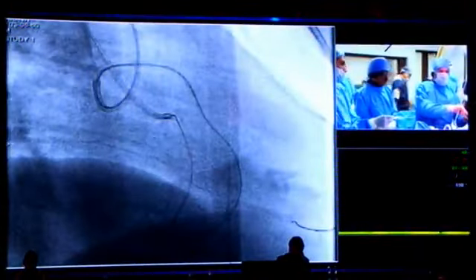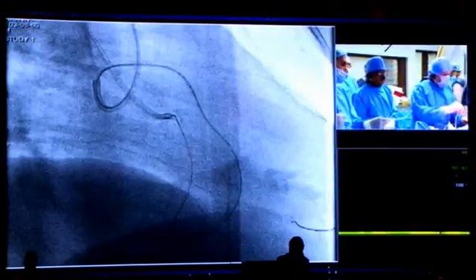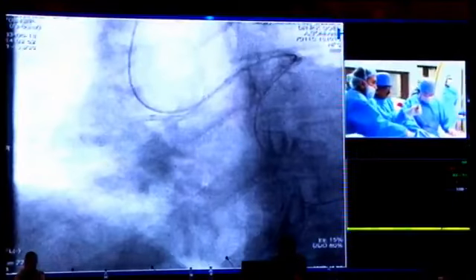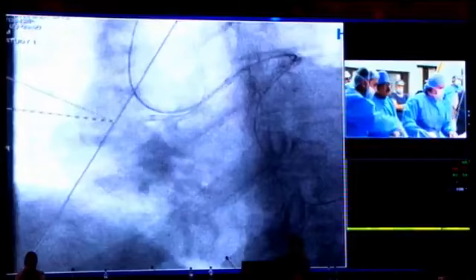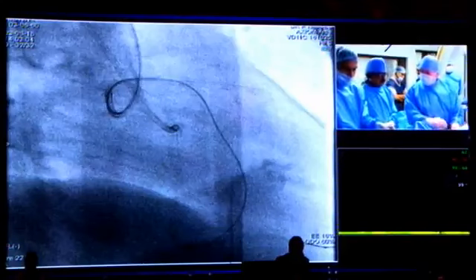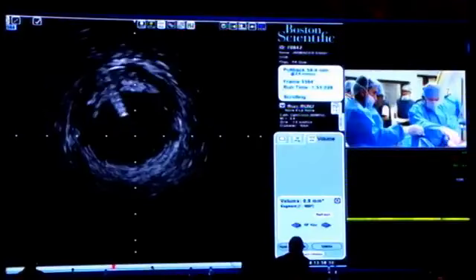Do we need to prepare a little bit more? Probably not. I think we've done 2.5s. Yeah, that's fine. We can do a 3.0 stent distally. I'll just get the Corsair a little bit more distal, so that we protect our collaterals. And then we prepare the stent. Can you get me a 3.0 38? Let's do a 3.0 38.